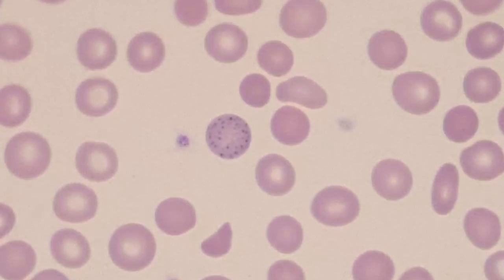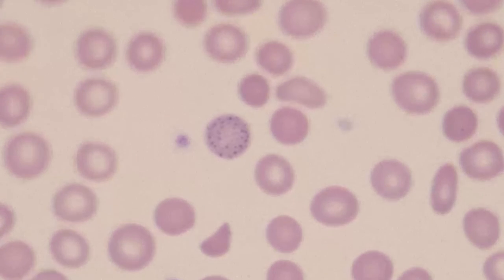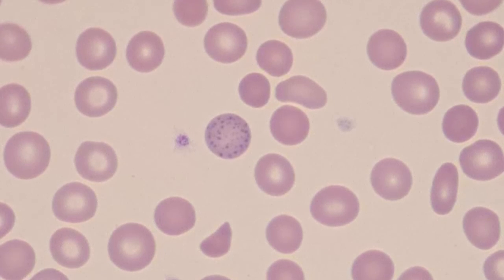Now, what differentiates Pappenheimer bodies from basophilic stippling is that basophilic stippling tends to be throughout the entire red blood cell, as you can see here, whereas Pappenheimer bodies tend to be just a few of them here and there along the edge. And we can see in this example that the basophilic stippling covers the entire cell.